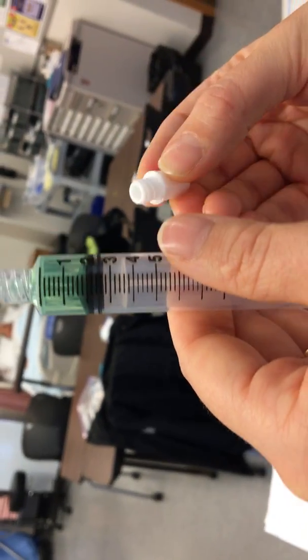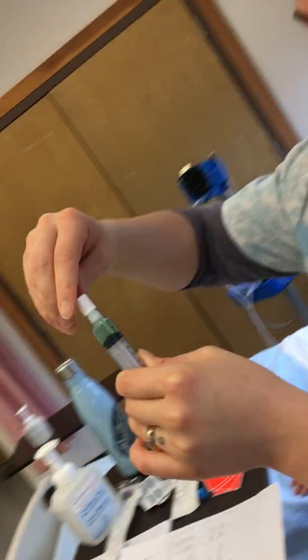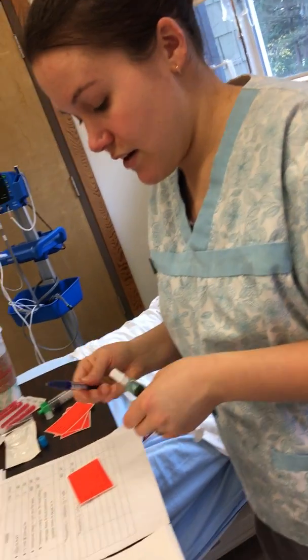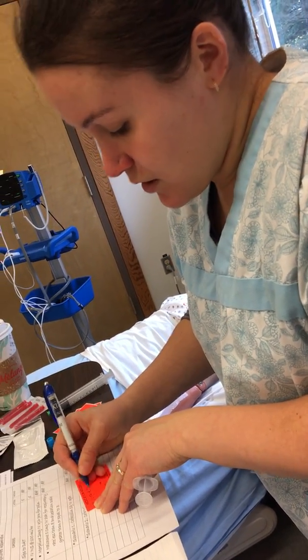Now I have 2 milliliters. I've continued to make sure that the tip of my syringe has not touched anything, keeping it sterile. And there. So now I'm going to add a label now that I have my dose. Morphine, blah, blah, blah.